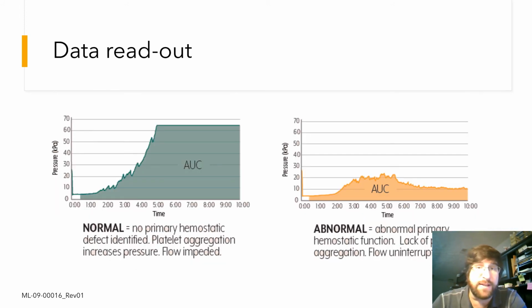As this occlusion progresses, the pressure required to maintain a constant flow rate increases and is measured and visualized graphically. As can be seen, the curve does not always ascend perfectly. These sudden drops in pressure occur when shear and lytic forces overcome the platelet-fibrin bonds and send a piece of clot down the channel and begin forming a new clot; it is a dynamic process. The 26 parallel channels allow for a smoothing out of the effects and for internal normalization of the individual channels. Data are reported out as the area under the curve, AUC. This number integrates the various drivers of primary hemostasis, the lag time to first formation, rate of platelet aggregation, as well as the dissolution of said aggregates.